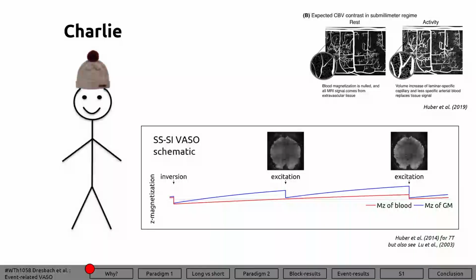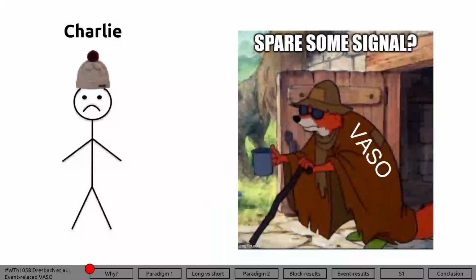Here you can already see one challenge for these types of acquisitions: we have this magnetization preparation in the beginning and we acquire 2 images. We're just inherently slower than with other types of sequences. The second problem is that these types of sequences are inherently SNR starved.